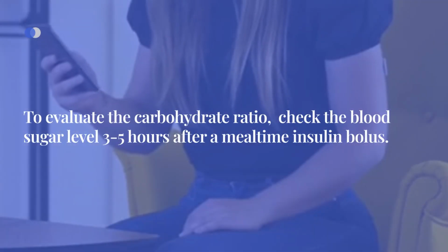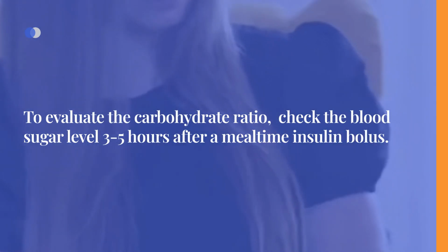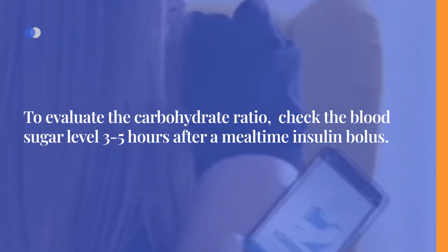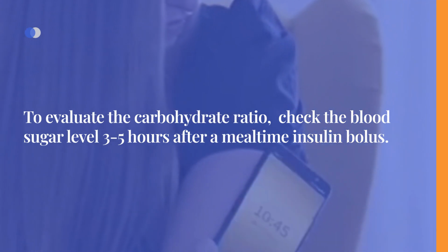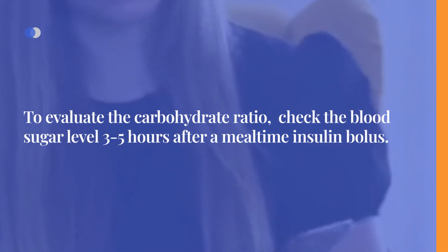To evaluate the carbohydrate ratio, check the blood sugar level 3 to 5 hours after an insulin bolus. It should return to pre-meal levels. If it is consistently higher or lower, consider adjusting the carbohydrate ratio by 10%.